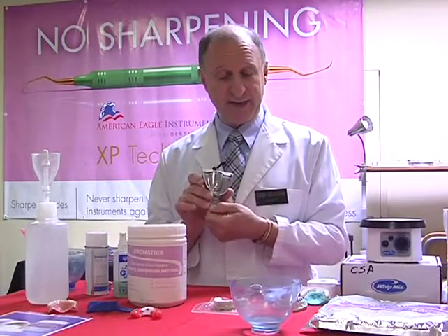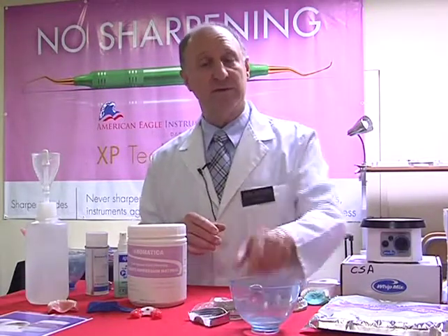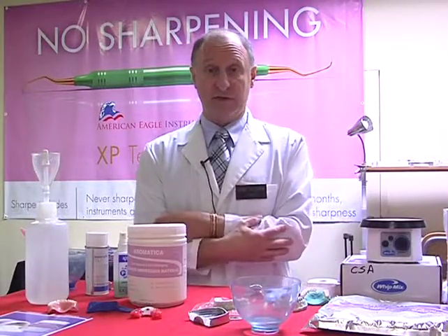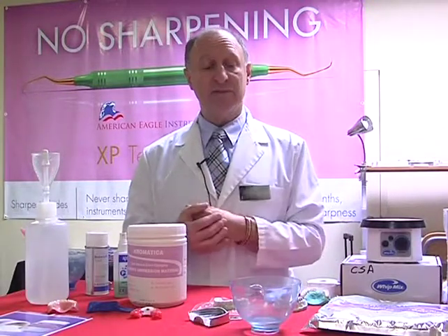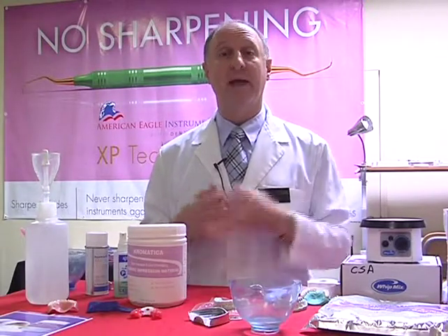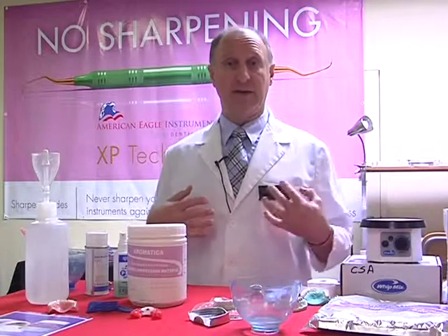So our tray is prepared. And this is what I would normally do. I have my patient who's sat in the chair, and I'm going to relax them because they're very nervous to start with. The best way to relax them is give them a glass of room temperature water. It relaxes the patients. You can see them bodily relaxing.